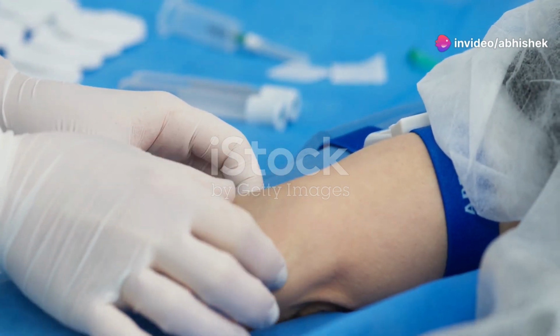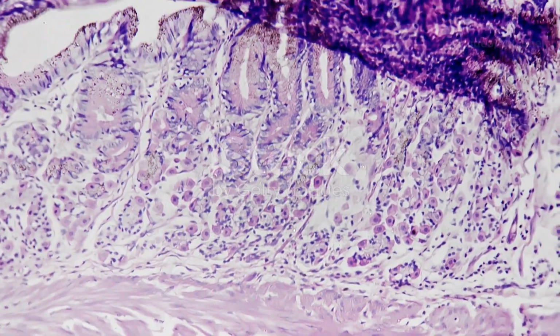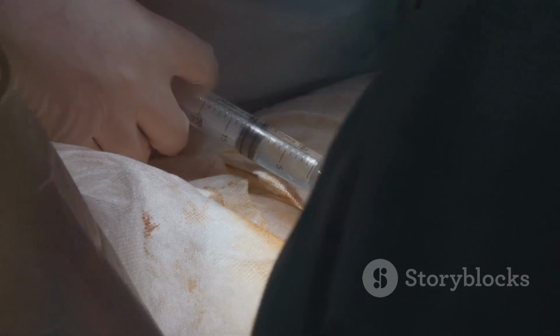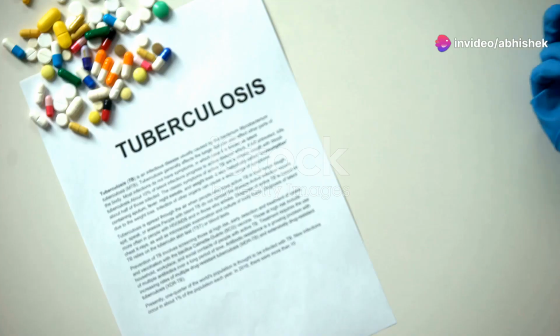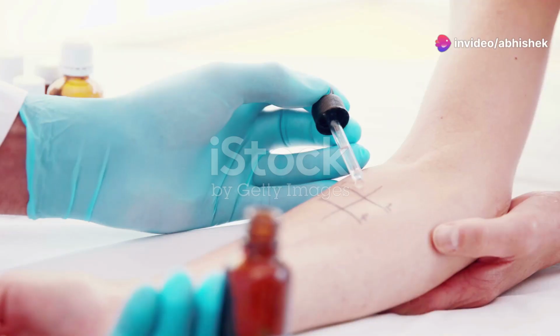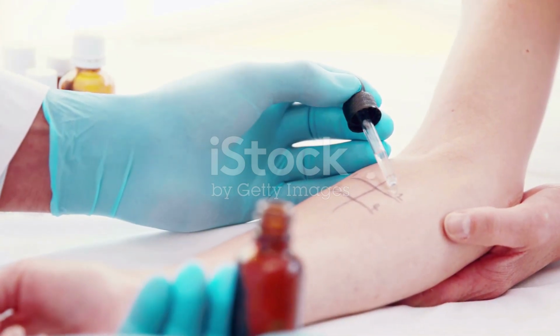Intradermal injections deliver medication into the dermis. The dermis is the layer of skin just beneath the epidermis. Absorption is slow and localized. The most common site for intradermal injections is the inner forearm. Intradermal injections are primarily used for tuberculosis skin tests, to detect exposure to TB bacteria, and allergy skin tests to identify allergens.